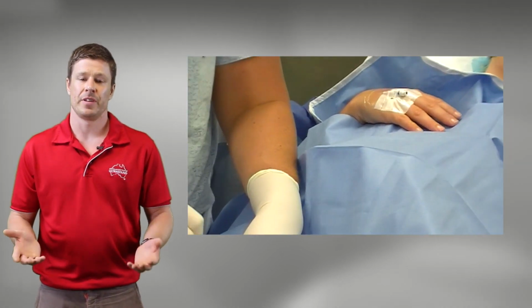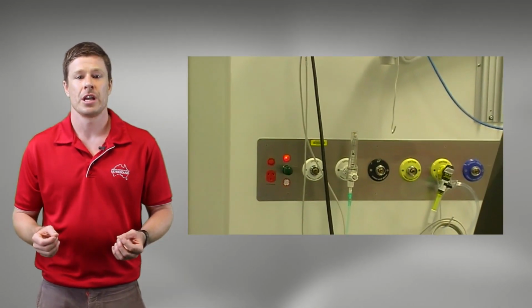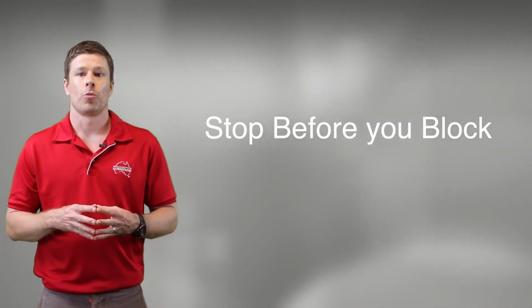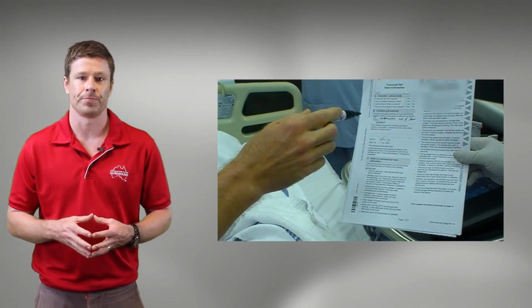The patient should be positioned in the supine position with intravenous access inserted, pulse oximetry and non-invasive blood pressure cuff, and supplemental oxygen if sedation is to be given. A stop before you block moment is performed once everything is prepared, and this should incorporate confirming the correct site and side to be blocked with the patient and the patient consent form. This is done to minimise the chance of wrong-sided blocks.